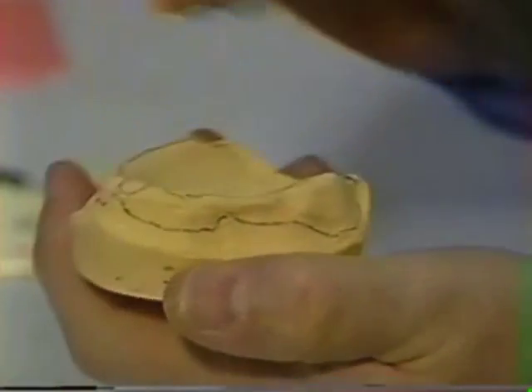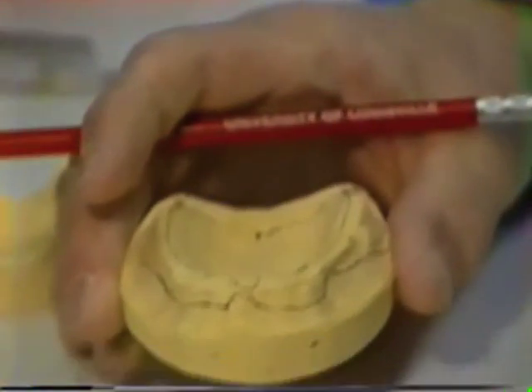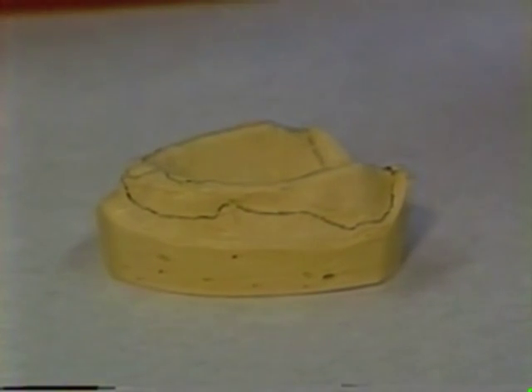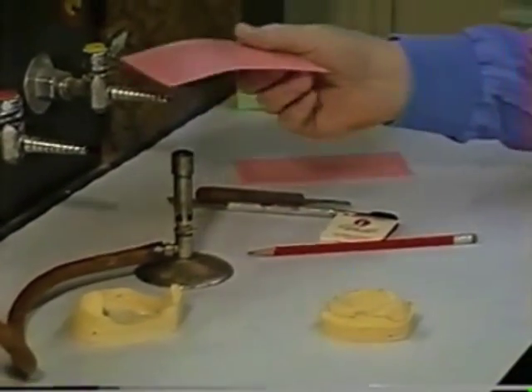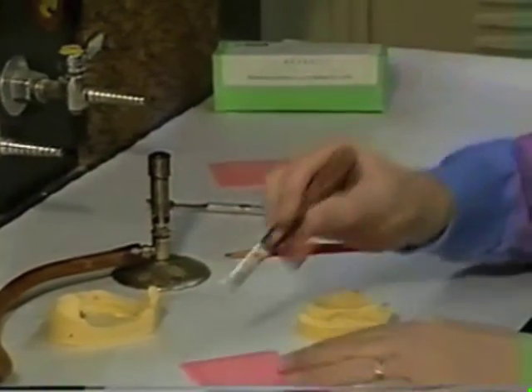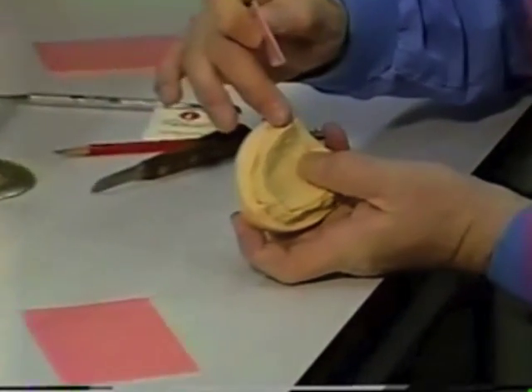So from the crest of the ridge facially, we will want 1 thickness of base plate wax as relief for the tray. We're going to use a sheet of base plate wax, and with a flame, heat that wax just to get it nice and pliable, and cut a strip of wax off that would be sufficient to cover half of the relief that we've planned, which would be this area.